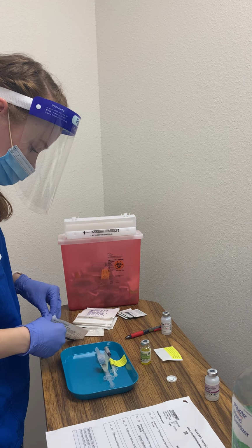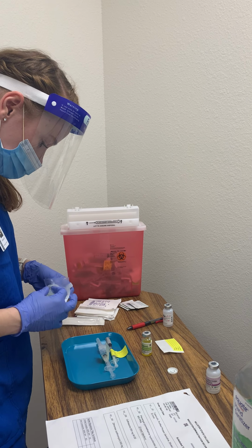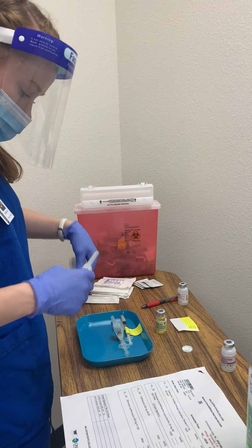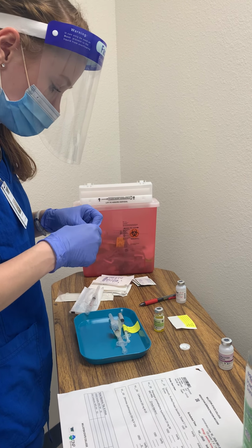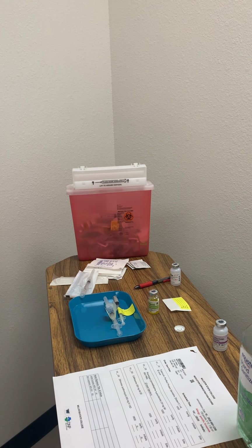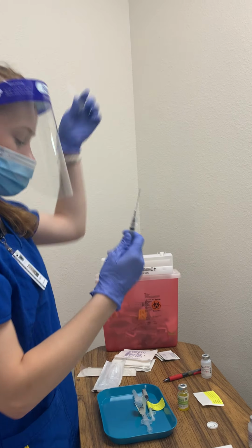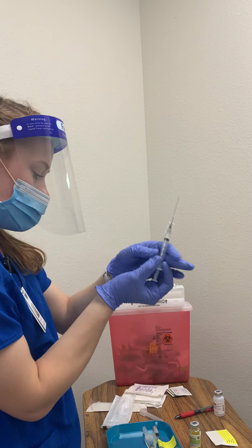So getting this. I got that. And then I'm just gonna re-wipe my top. So then I'm gonna pull back to 1/2 ml with my dimensional analysis.